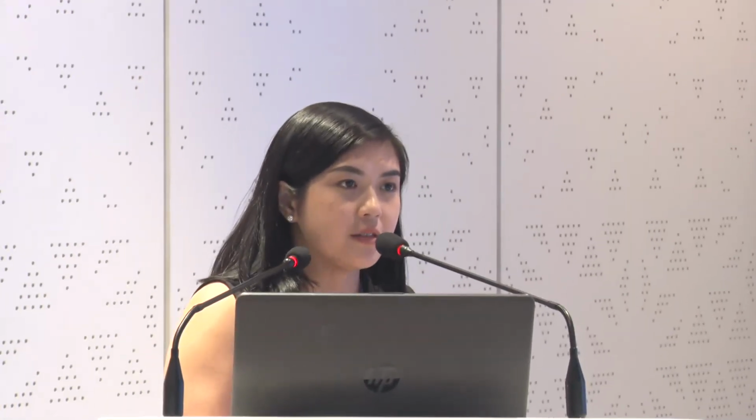I've implanted around 250 lenses in the last year, and all of these patients require plus 1.5 diopter of spherical correction for near vision. May I ask your target for the lens? The distance target was zero, they were targeting for plano.